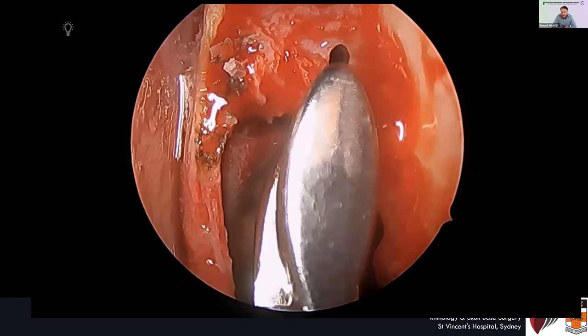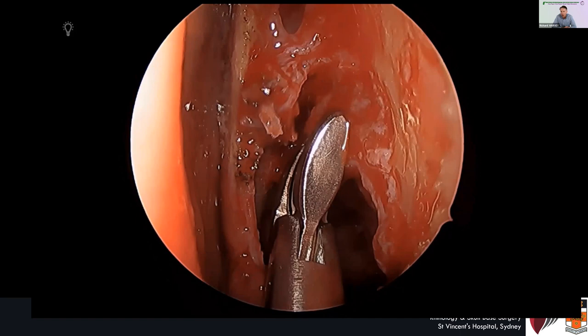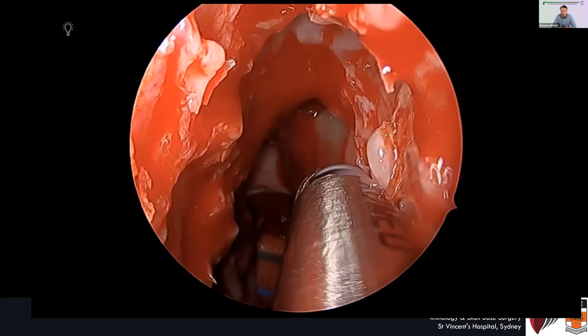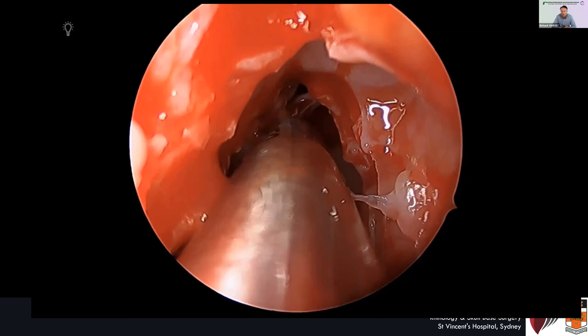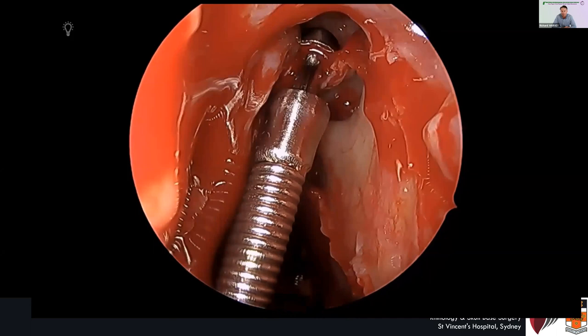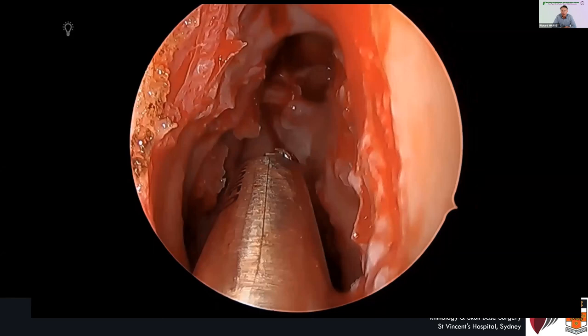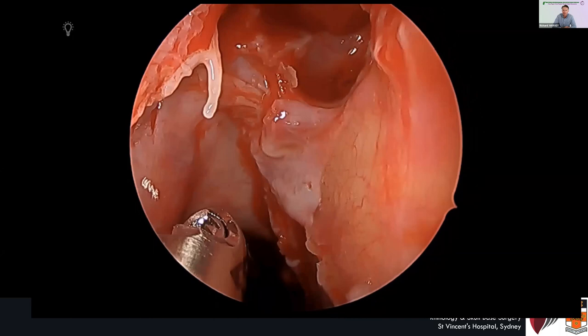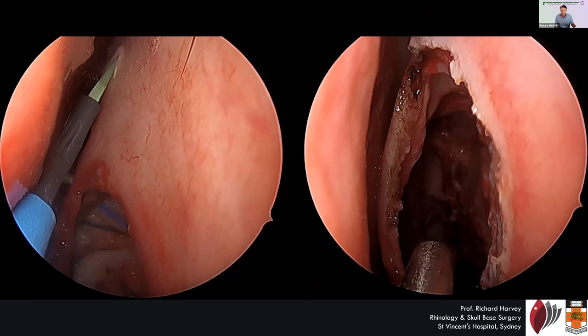When you take this bone off, you are exposing the front wall of the frontal sinus — or the frontal recess. You can put a straight shaver in and it gives you great access. You can see almost up to the top, still using a straight instrument. I've got a Hoseman punch, still with a zero-degree scope in. Even the quad cut comes back in here with a straight shaver. Just by taking that window off, you get great access.